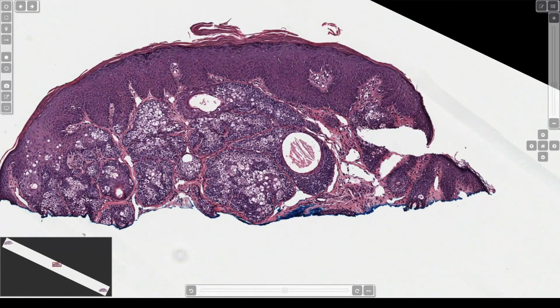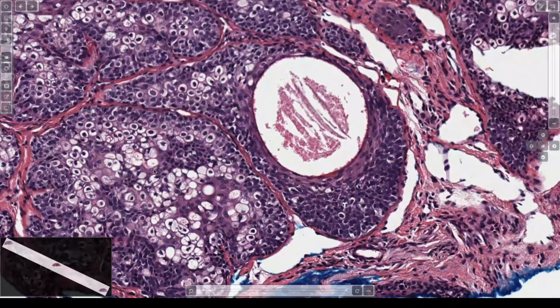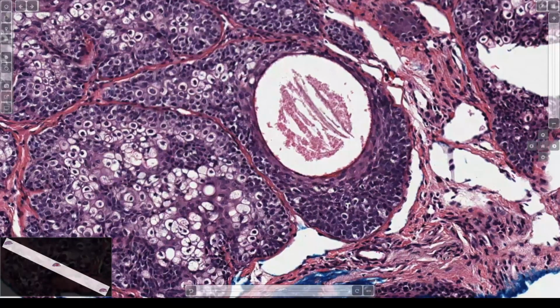This is a small lesion. It looks like they got most of it with the shave. I think arguably there's more than 50% bubbly cells here. And you can't really see the bubbles real well, but they are little vacuoles and they're clear because they're filled with lipid and they dent into the nucleus.